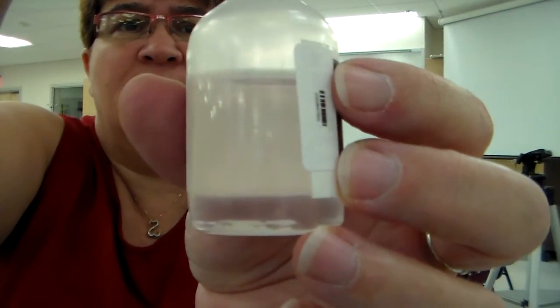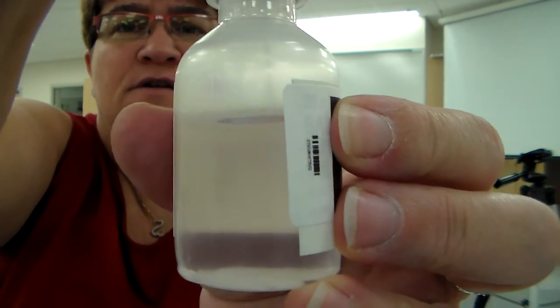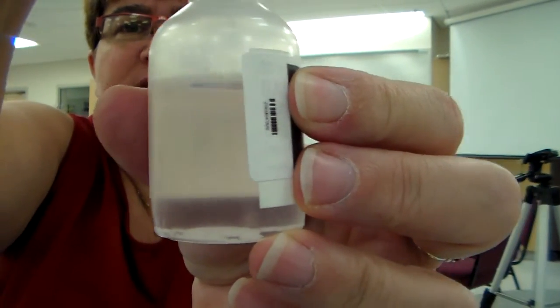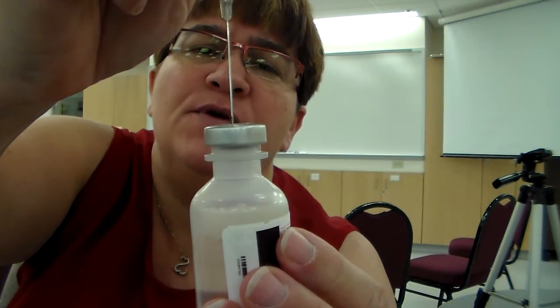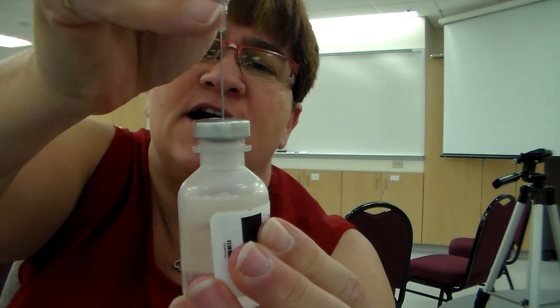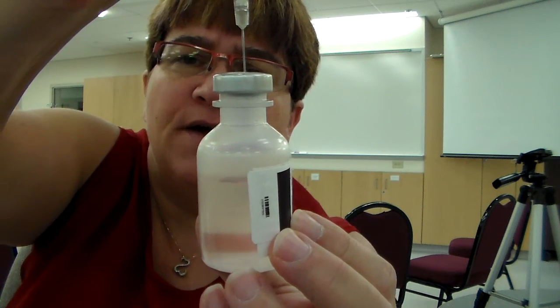Let's see if I can do it again. Okay, watch. See, there was air that got, I instilled air into the liquid. I don't want to do that, okay? I want to just instill 3 milliliters of air into the air space that's already there. So I'm just barely putting my needle into that stopper, okay, and instill air, okay?